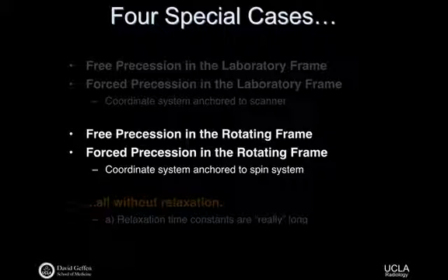We only have one component. It only falls into the i category, if you will. That should be a prime. And so we have a B1 envelope of t here. We don't have any j component or any z component to our effective B field. Sorry, there should be a gamma in there. It's even in my notes. So don't miss the gamma here.